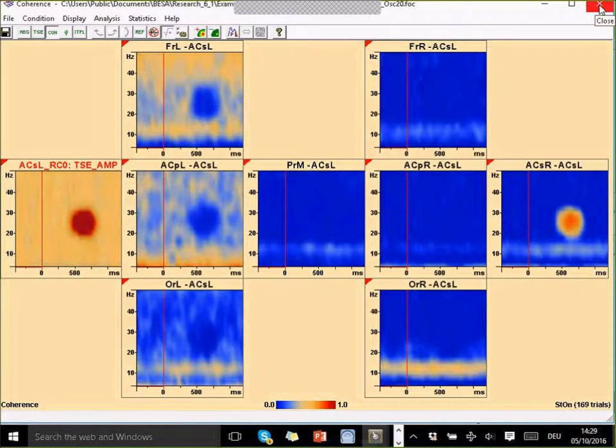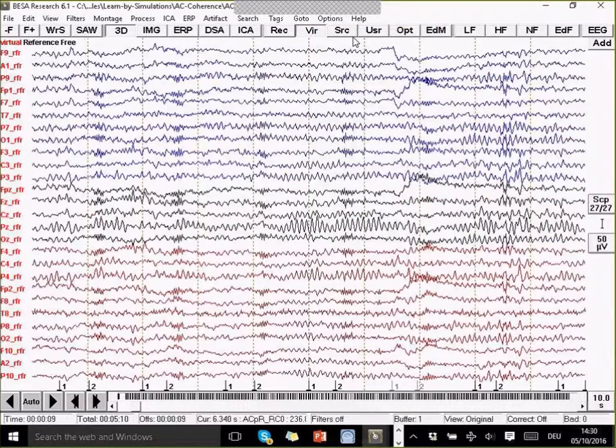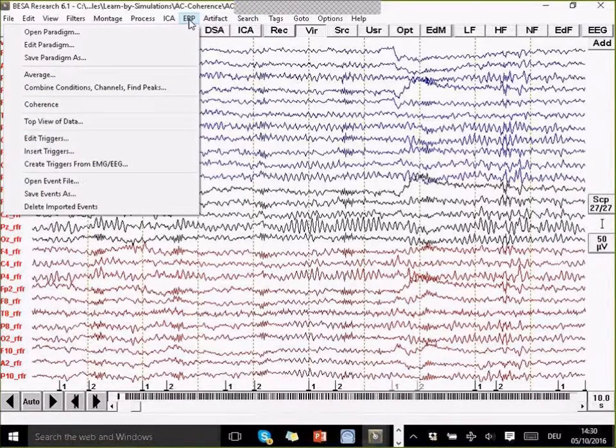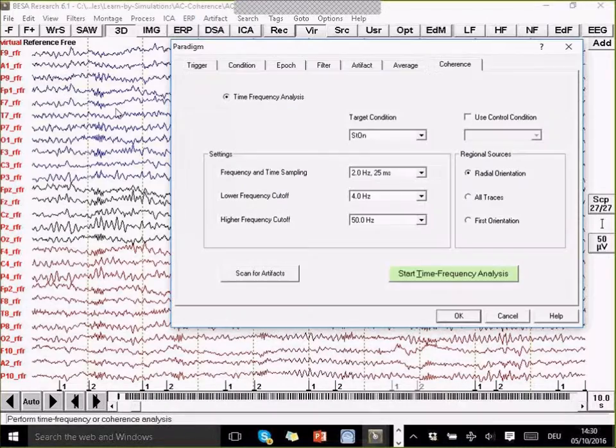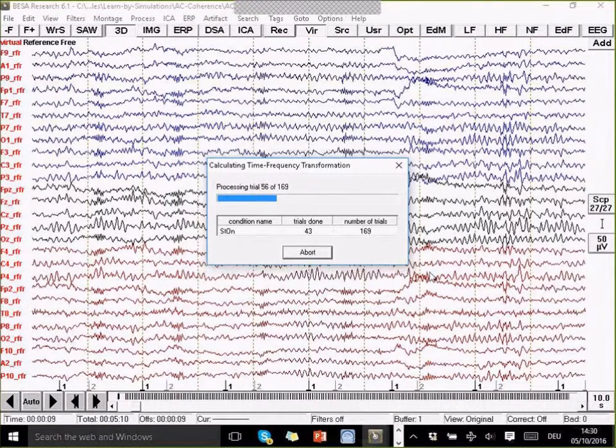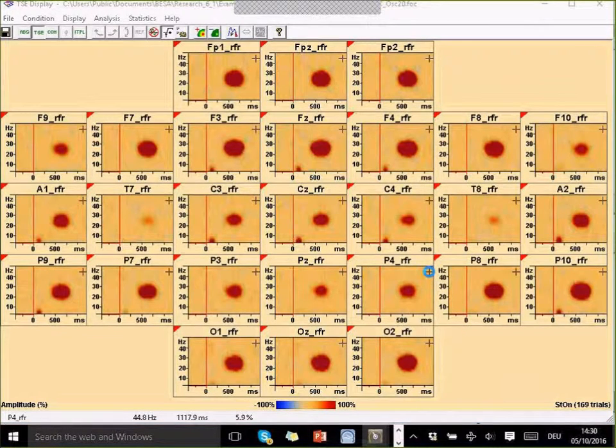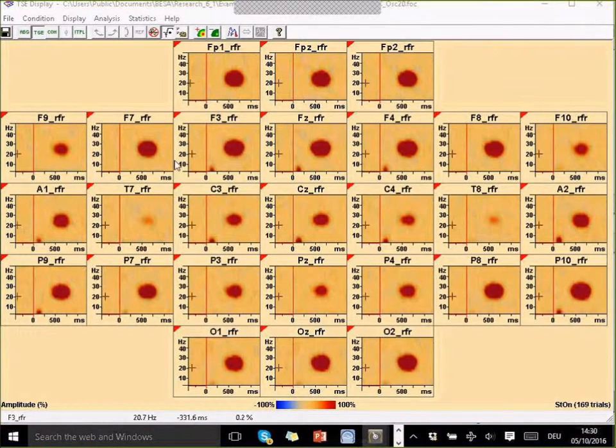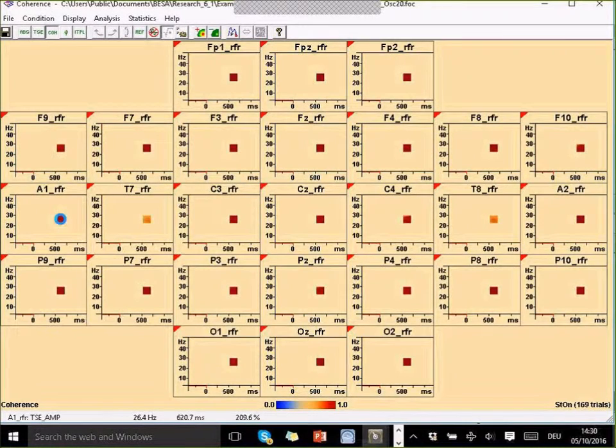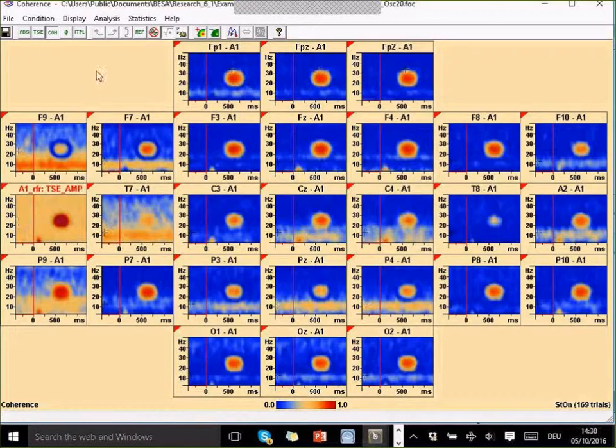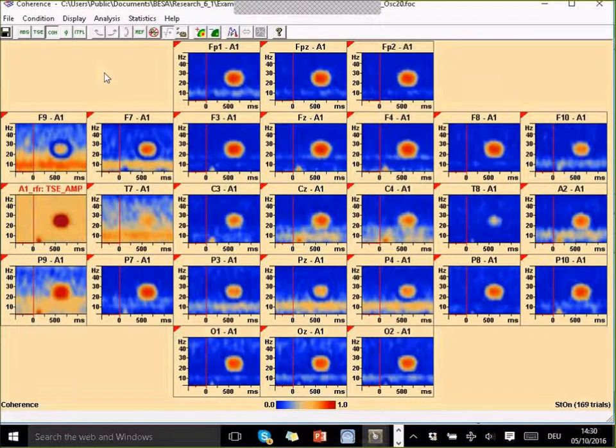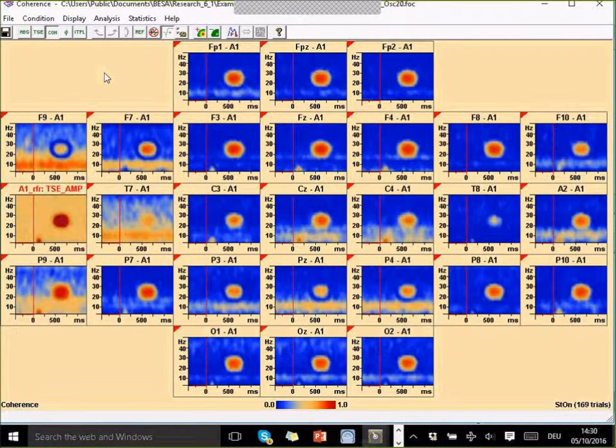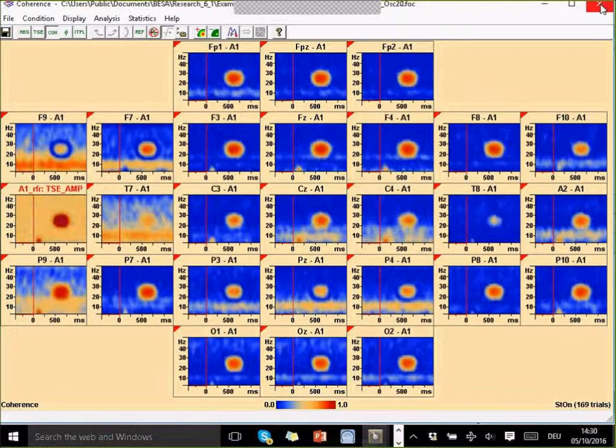Let's compare this to the scalp coherence. If I go and pick the reference-free montage, for example, for a standard montage and do the coherence analysis on this. I now go back to ERP coherence, start the time-frequency analysis and run through the trials. Now I can see that I get this oscillatory activity in nearly all the channels. And also if I double-click on say A1 to get the coherence of this channel with the other channels, I also get coherence with nearly all the other channels. And this is this volume conduction propagation effect over the scalp that actually doesn't allow me to distinguish between what is real coherence and what is actually simply due to propagation of activity.